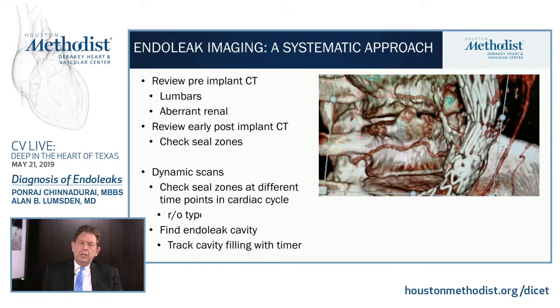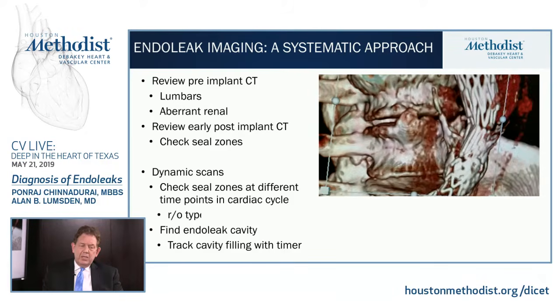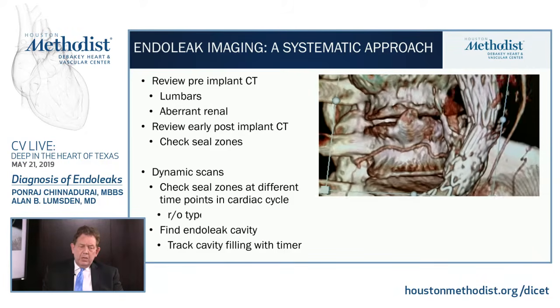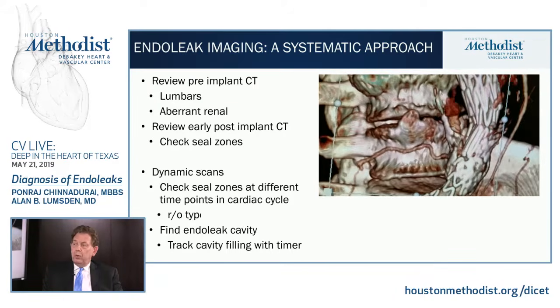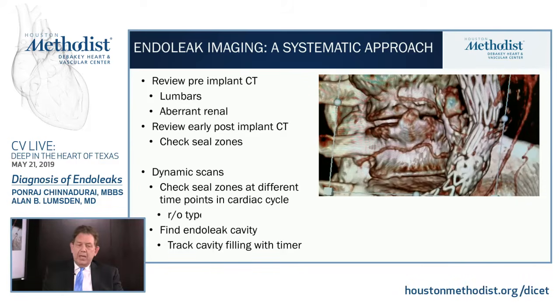So let me show you what I mean by a dynamic CT scan. This is a patient who we're doing, and you can see the inflow through probably the L4 lumbar and the outflow perhaps through the L3. And that lets us know exactly what perhaps the predominant flow actually is.